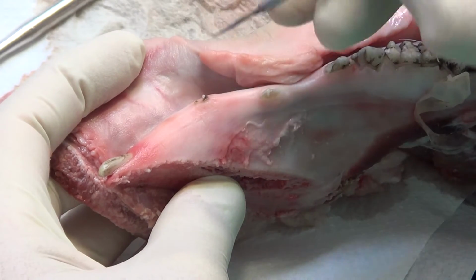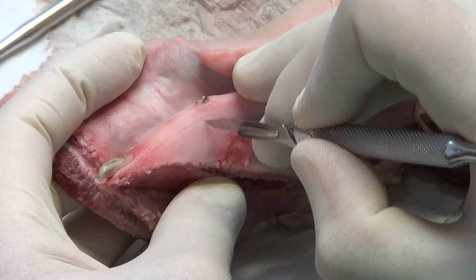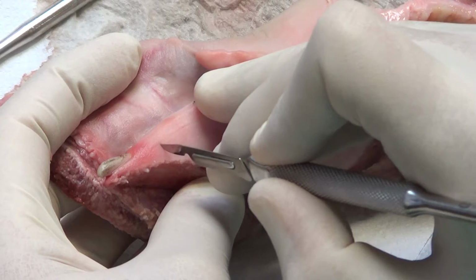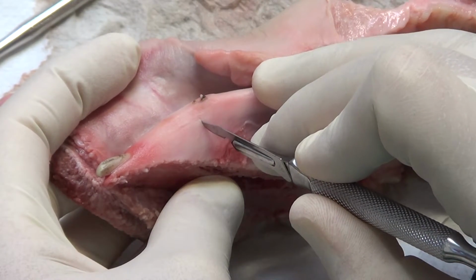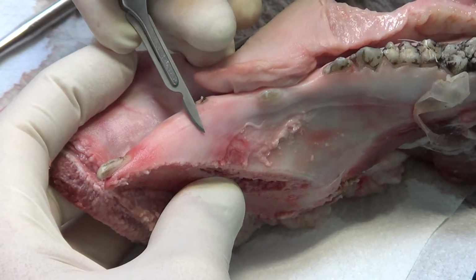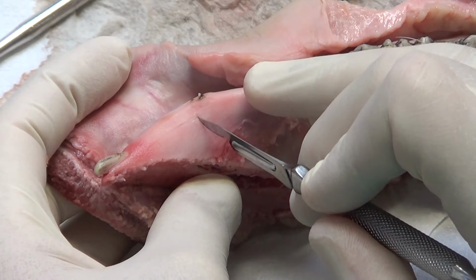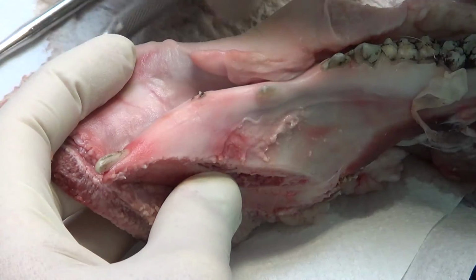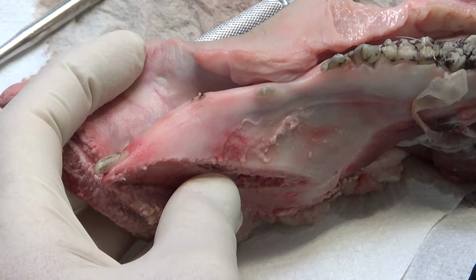And remember that during this procedure you are perpendicular to the long axis of the tooth. Imagine that this is the palate, so I am perpendicular to the long axis, because only after this procedure I will go parallel to the long axis. But now I am perpendicular. 1, 2, so 1, 2, 3. Try to do that, and then we will start the next step.